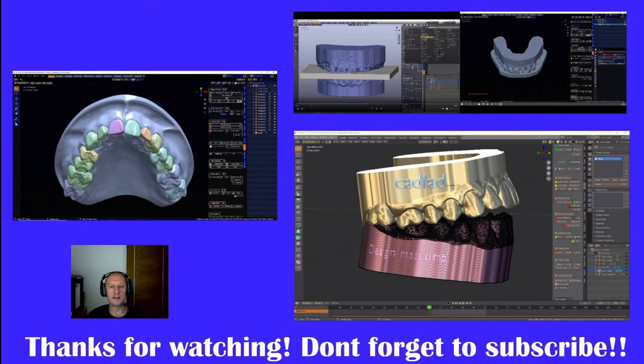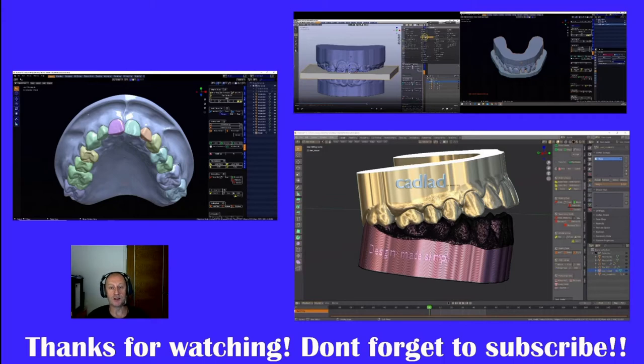Hi, welcome. This is Andrew Wheeler and this week we're going to be going through the Wax-Up module, which has just been released by the guys at Blender for Dental.